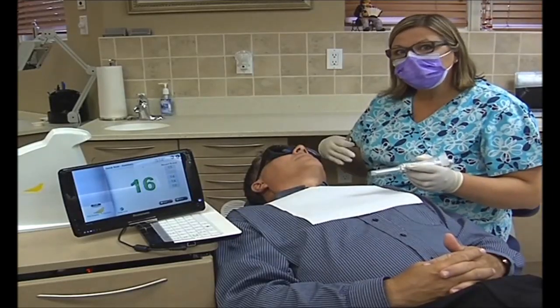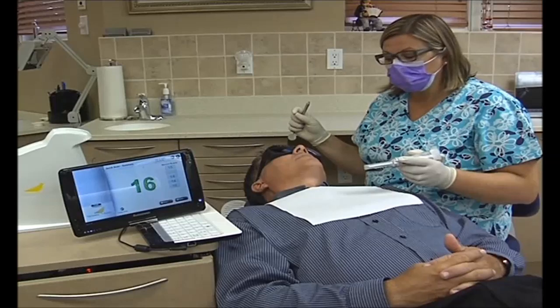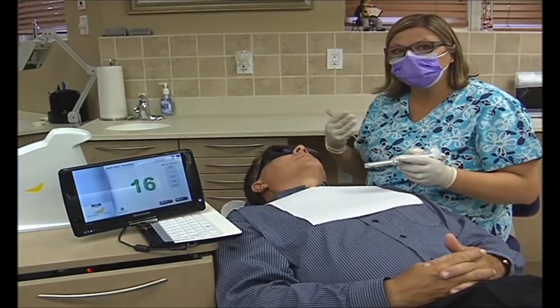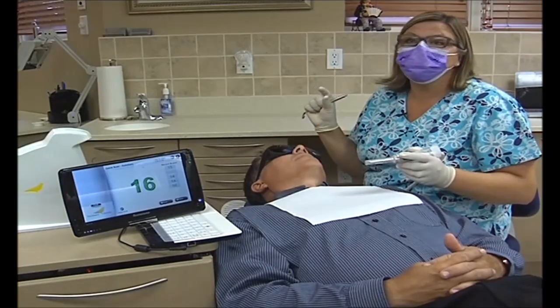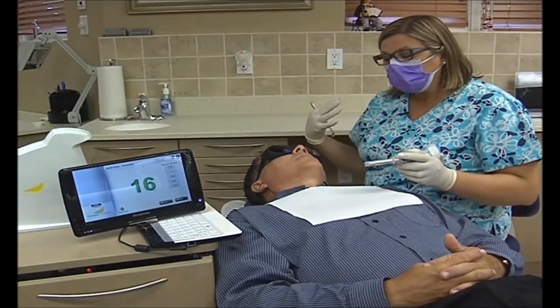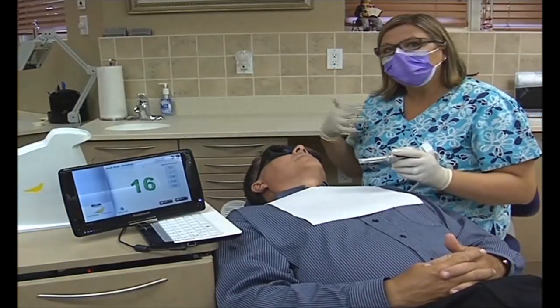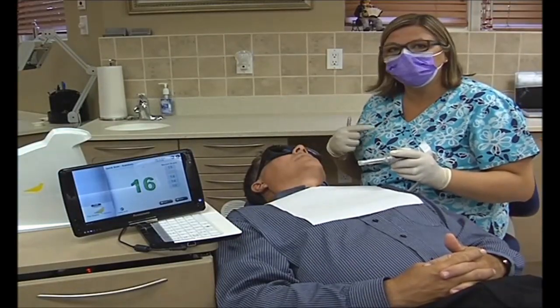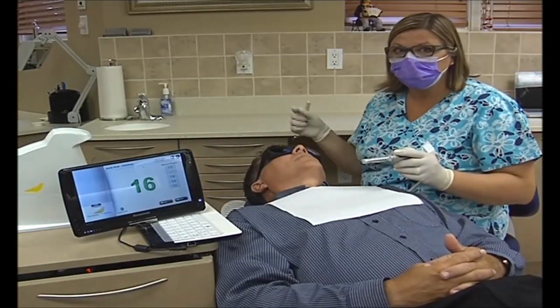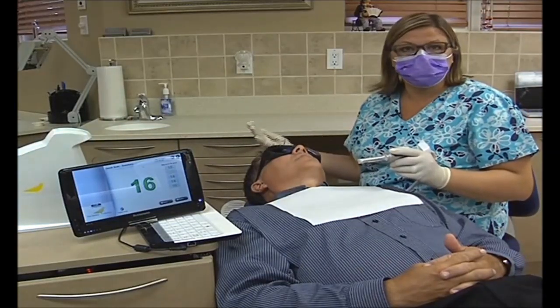That's one way I would use it at the end of a recall appointment — just check a couple of old restorations, write down the teeth I've checked, jot down the number. Every time a patient comes in, I'll do a couple of teeth so that maybe over the next two years I've scanned every single tooth. We incorporate that as about two minutes at the end of a recall appointment. If there's a high number, the doctor can come in, verify what's going on, and fill it. If there's no decay, we just monitor it and check it next time.